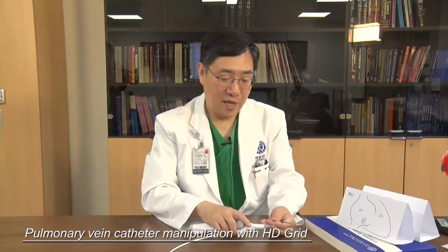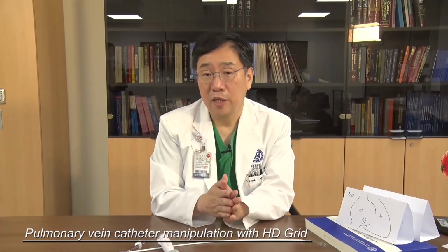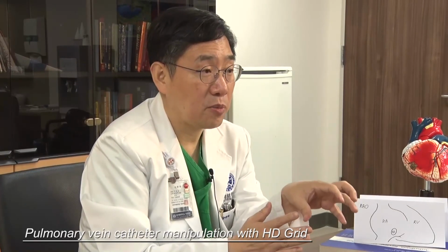It's not easy to engage the inferior pulmonary vein. You need to watch the angiogram you took at the beginning of the procedure and imagine where the patient's inferior pulmonary vein is located, and probably you will succeed.